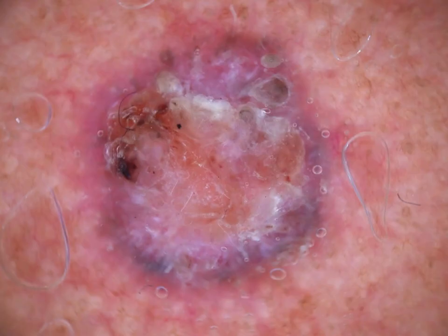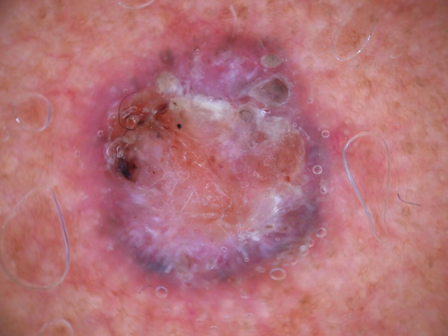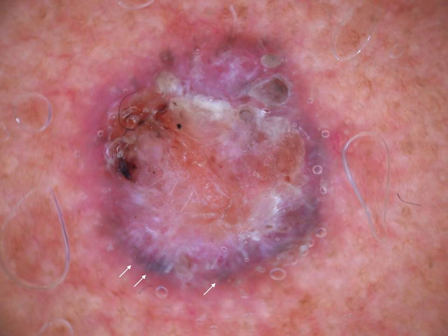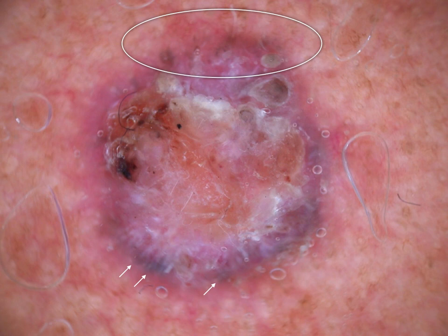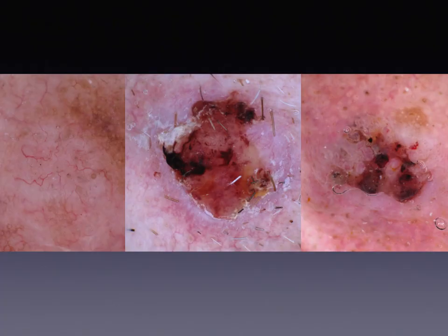One more example, shown both clinically and dermatoscopically. Dermatoscopically, we can see hyperkeratosis — a clue for squamous cell carcinoma — and also some white follicles in the upper part, again an SCC clue. At the periphery, there are bluish-grayish globules representing a BCC clue. In the upper part, brownish peripheral structures resemble the leaf-like areas of basal cell carcinoma. So again, a combination of BCC clues and SCC clues.